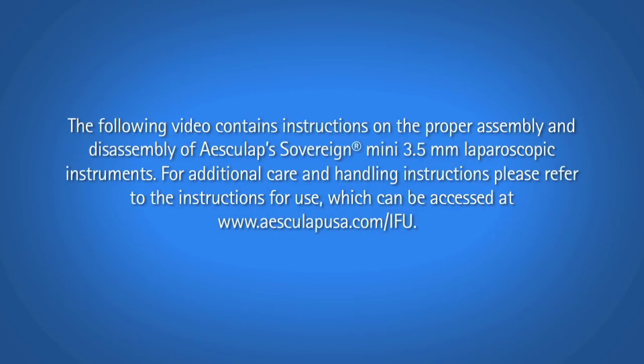The following video contains instructions on the proper assembly and disassembly of Aesculap's Sovereign Mini 3.5 millimeter laparoscopic instruments. For additional care and handling instructions, please refer to the instructions for use which can be accessed at www.aesculapusa.com/IFU.